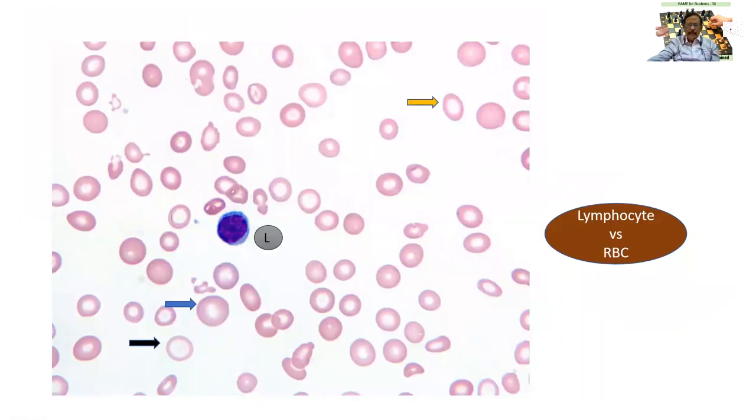Again, a nice picture. One thing that is striking is again the pallor of the smear. I am finding a large number of cells which are literally pale. Pale in the sense they have got lesser amount of hemoglobinization, greater amount of clear zone in the center. This is a classical example. This can be described as a pessary cell or a ring cell. Compare this with almost a normocyte or a macrocyte in this region. And this lymphocyte is pertinently given in this field so that you people can compare and find out.